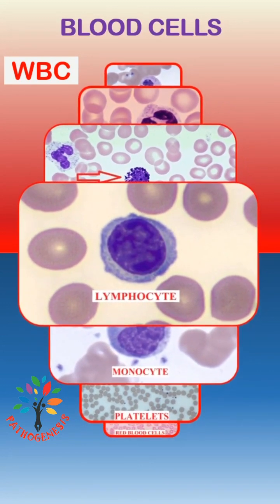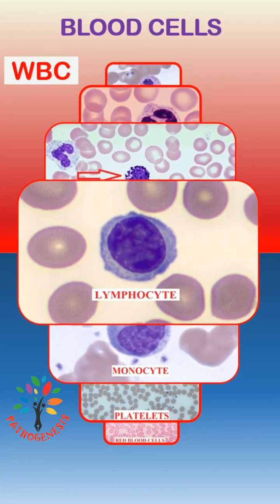Lymphocyte is an agranulocyte. Nucleus is round with coarsely clumped chromatin. It has a very small amount of blue color cytoplasm with no granules.